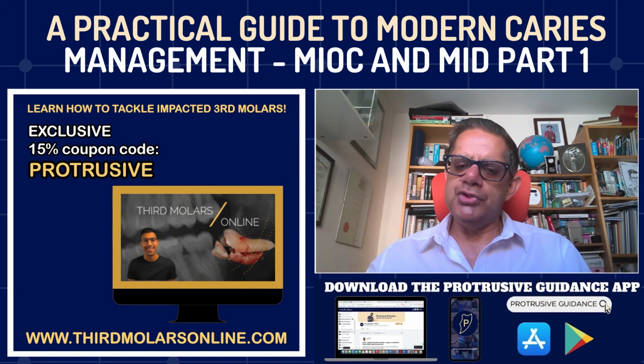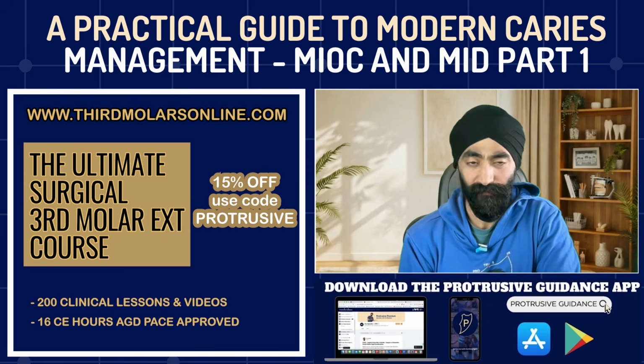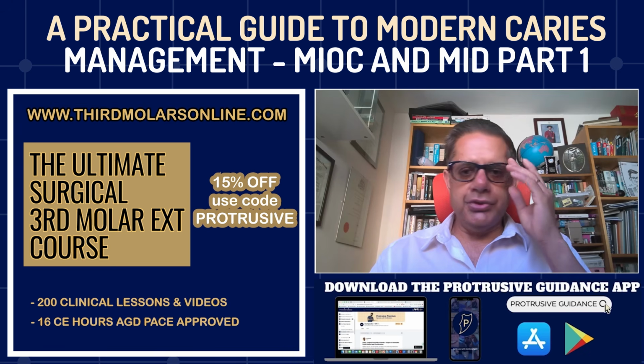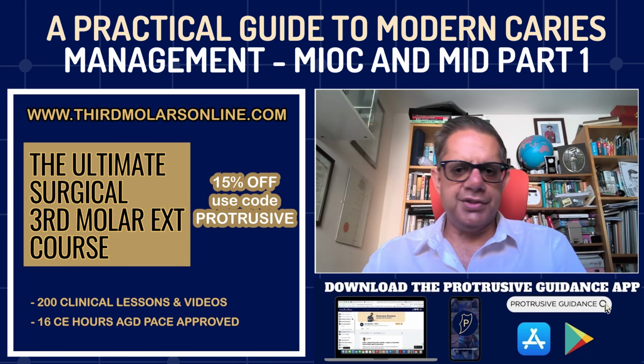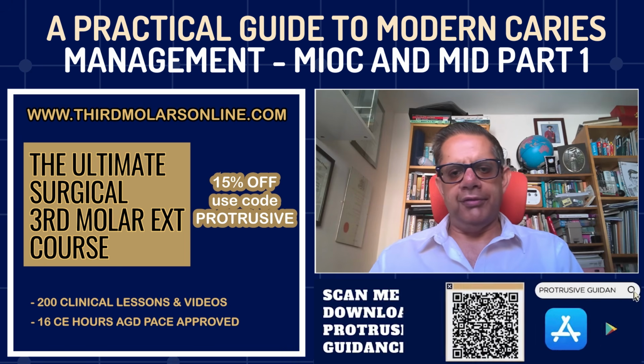And what you do is you triangulate. So you will do your clinical examination carefully. You will take good quality rads, because that's still part of it. You will use your other fluorescence detection devices or whatever else. You can then use AI on top of that if you want to.